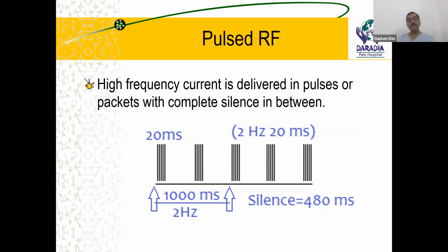And what happens? Here there will be a strong electromagnetic field which might have the clinical effect. It is not going to ablate anything. It will have the effect because of the strong electromagnetic field generated at the tip of the radio frequency needle.